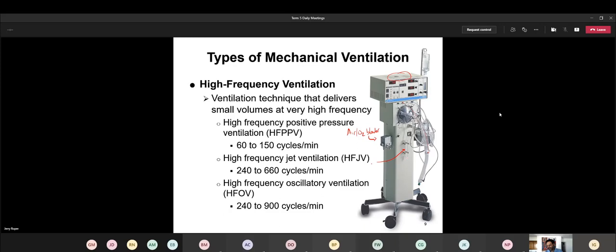And this is kind of like our drain bag, if you want to think of it that way. It collects condensation here. So you just keep an eye on that, and when it gets to be about full, it's draining from here. This is called the diaphragm here. So once it's draining all of that liquid, you'll have to go in and take care of it and empty it out as needed.